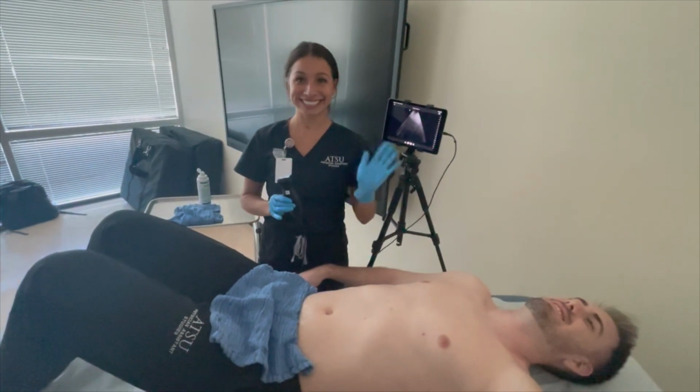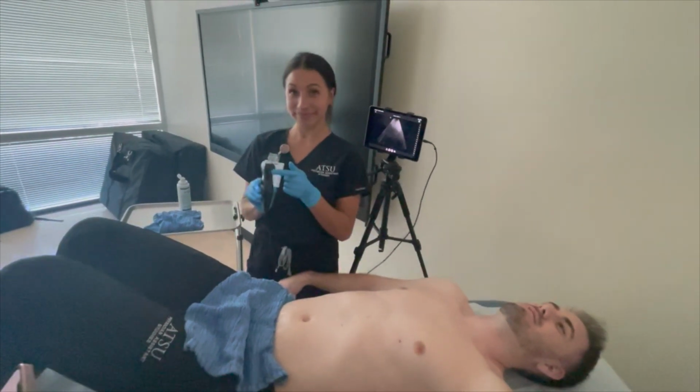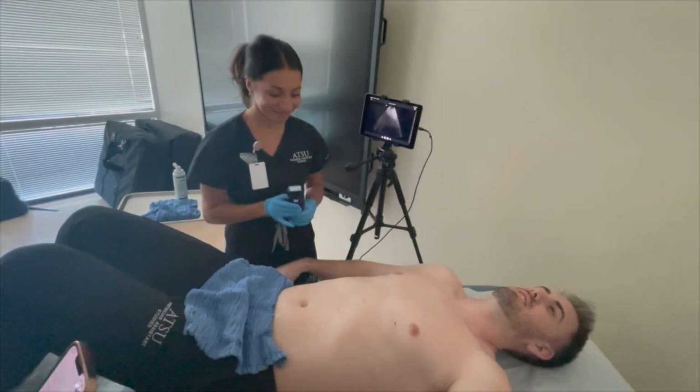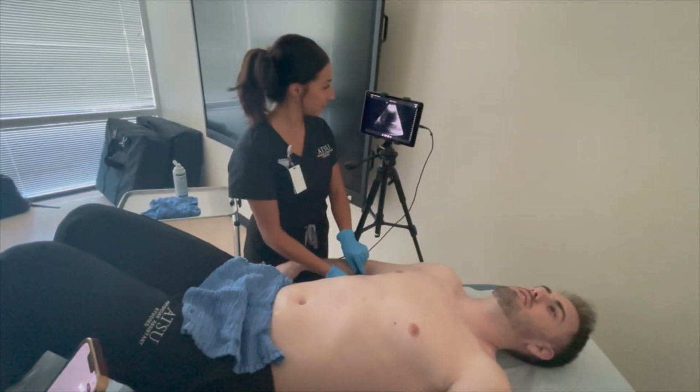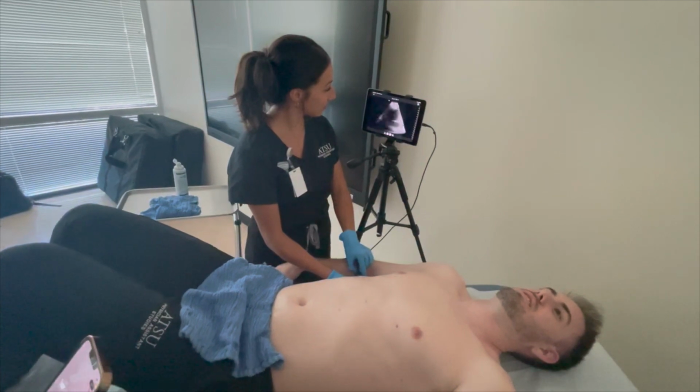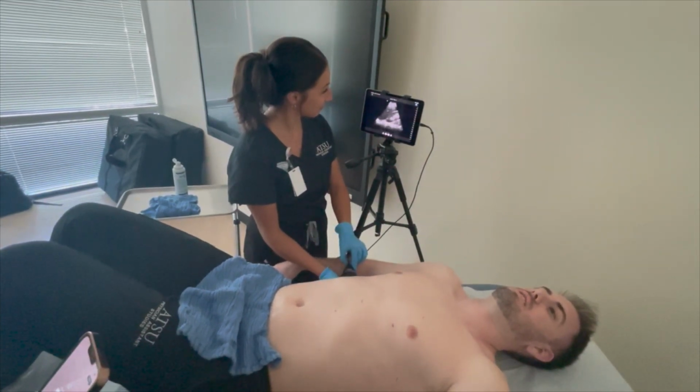Okay, so we're going to start with the right upper quadrant. The indicator will be pointed towards the head of the patient. Anchor the probe in the mid-axillary line at the 10th intercostal space. It's used to identify the lung, liver, Morrison's pouch, diaphragm, and the right kidney.